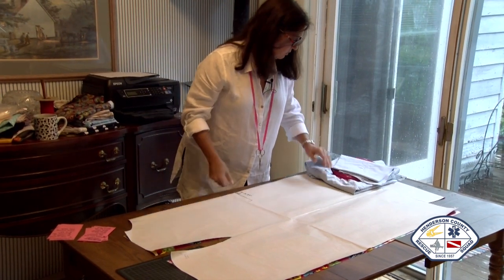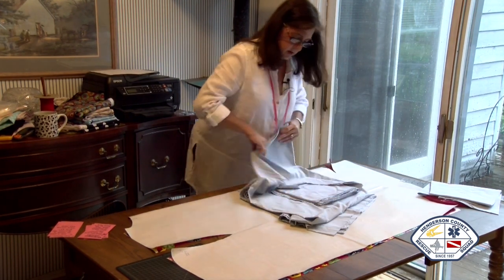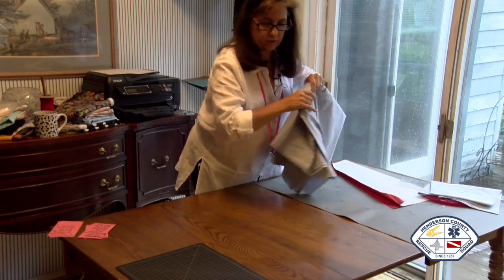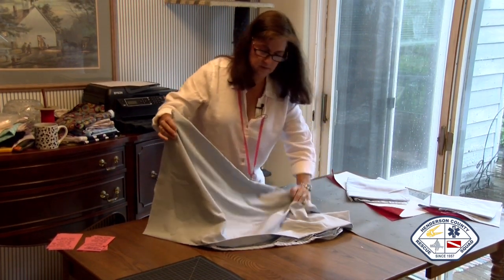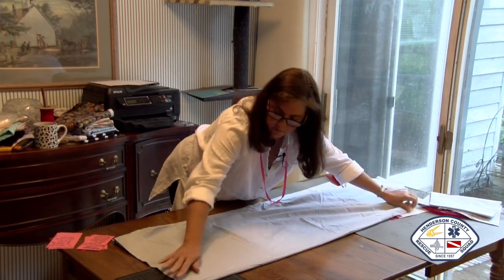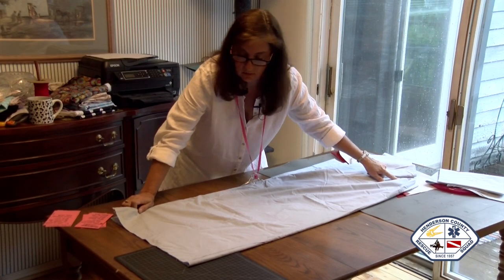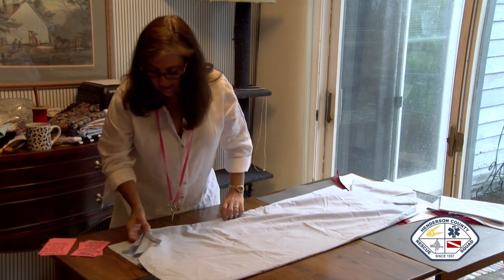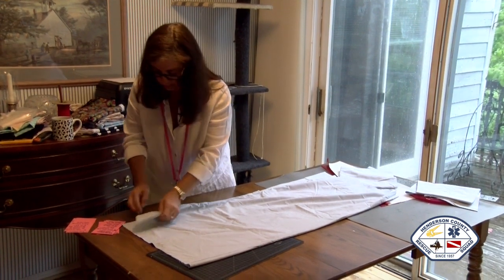Now, what I have done, let's get rid of this pattern paper, because it's going to go on top when you mark your fabric. Now, we have your fabric, 44 inches down now, because that's how long it's going to be, and it's going to be 57 inches around. That way it will fit any kind of personnel that is going to come in to the room.